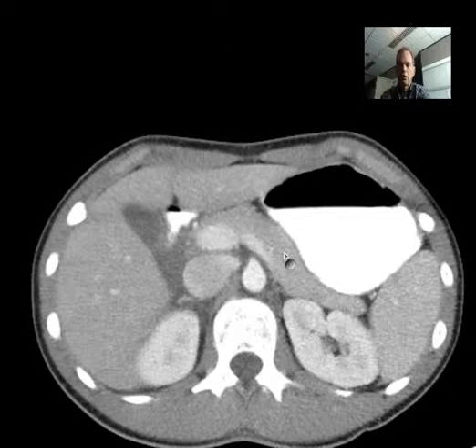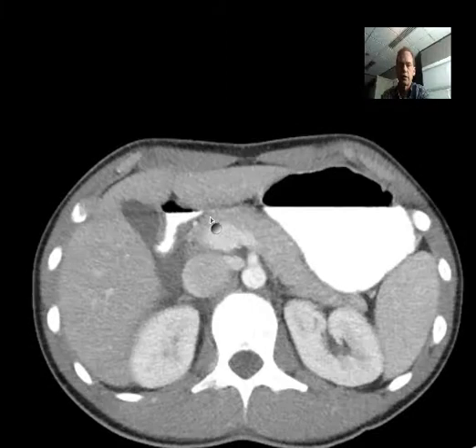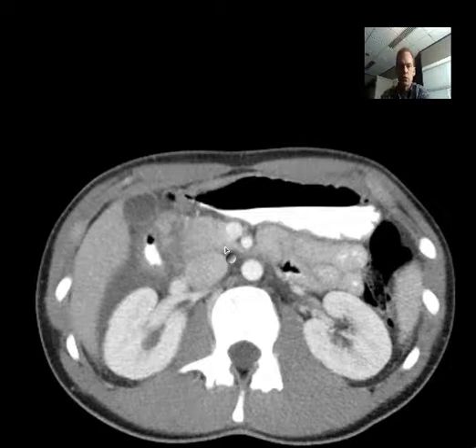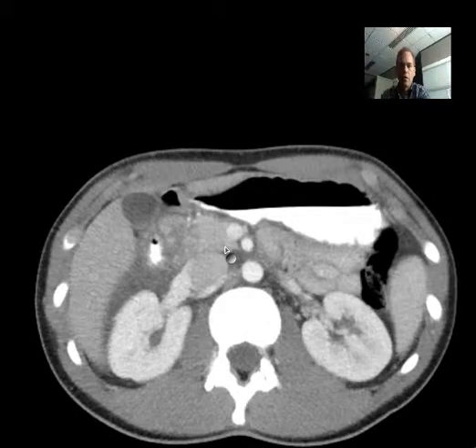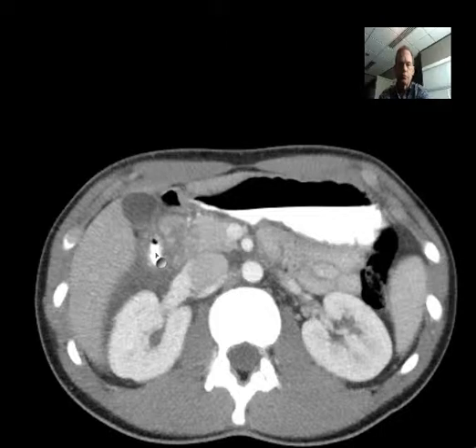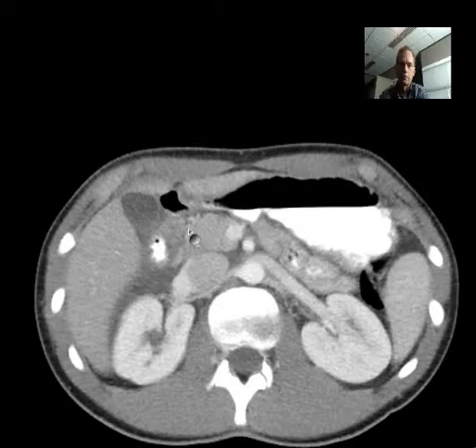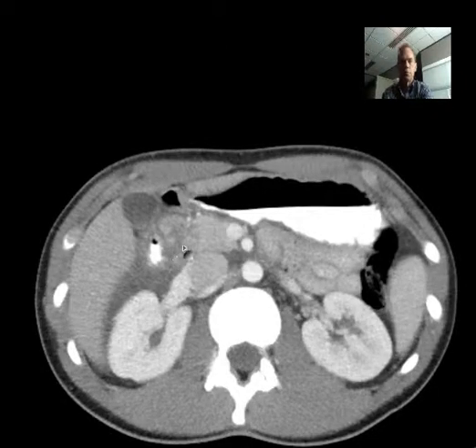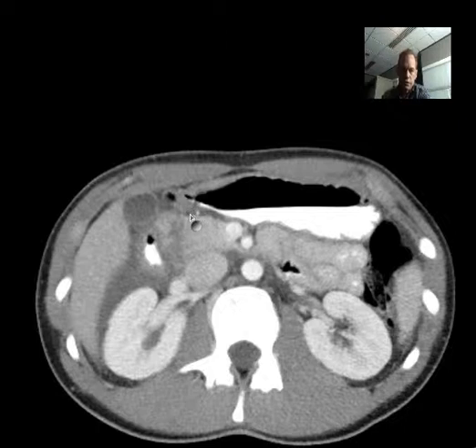Here's the pancreatic tail, body, neck, and then we go a little bit more to the right — here's the head, part of the head. This is the uncinate process, curving posteriorly there. And what we have here is the duodenum. We have oral contrast in the duodenum, which is very helpful because it shows us where the duodenum is. This relatively low attenuation area here and here is fluid — I presume blood. And what we actually have here is a transection through the head of the pancreas.